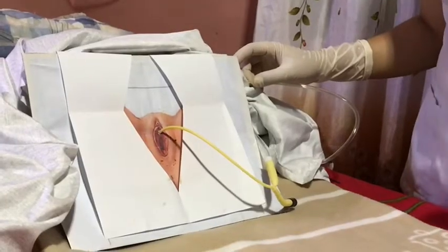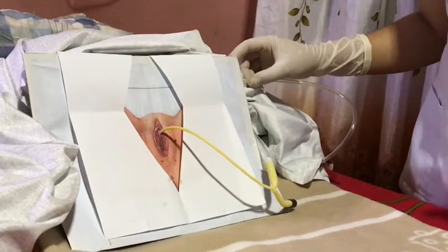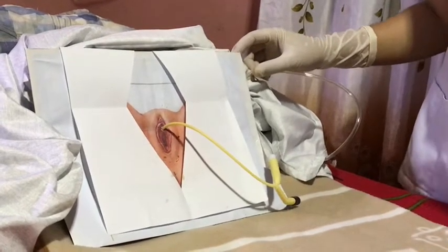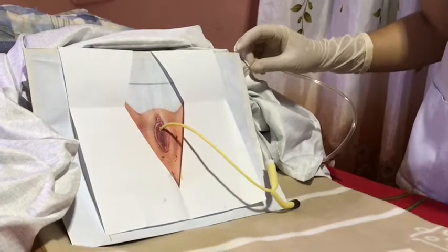Now secure the indwelling catheter by taping it to the patient's thigh and allow some slack of the tubing to accommodate the patient's movement.